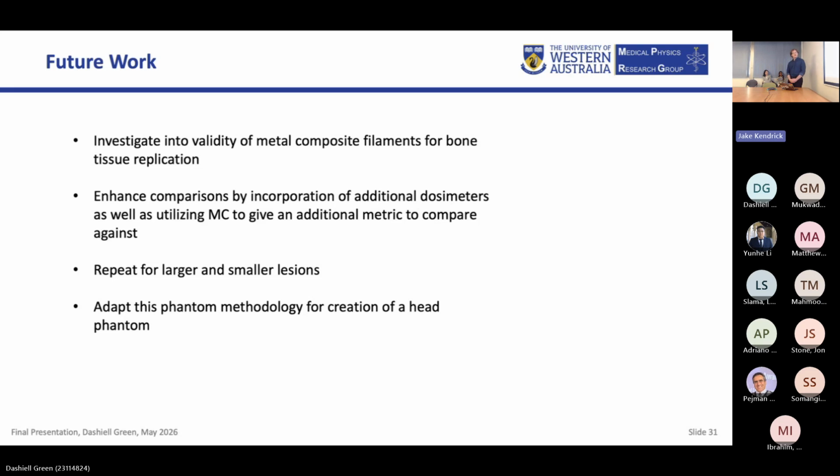And then finally, adapting this phantom methodology to a head phantom for use in brachy, because of the air gaps present in your head, in your nose. These would want to be looked at, given TG43 is used currently and doesn't account for these air gaps.